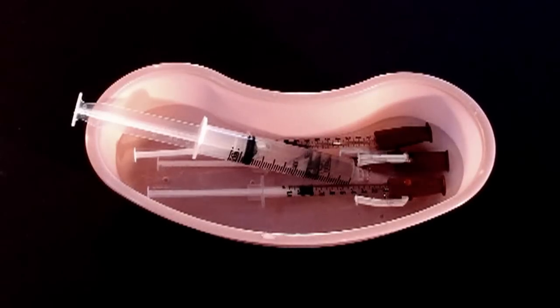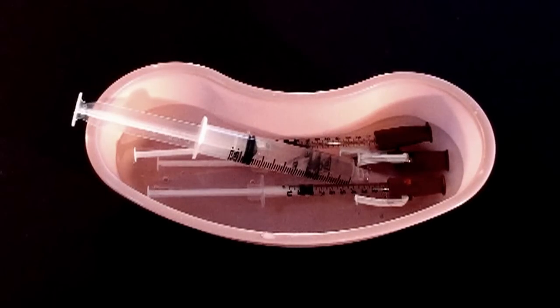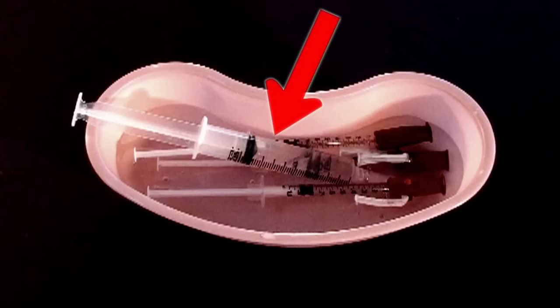I like to use PPD syringes because the needles are super tiny and you can control the injection really well. I also use one larger syringe with a large-bore needle, and we'll see why I do that later.